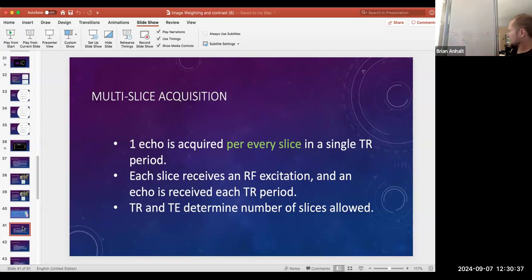So in this case, let's just keep going down here. Let's say, I'm not going to do different colors, it's going to take forever. Right there, that's about as far as I can go. So I had 1, 2, 3, 4, 5, 6, 7, 8, 9 slices available to me, right? If I needed a 10th slice, what would I need to do?